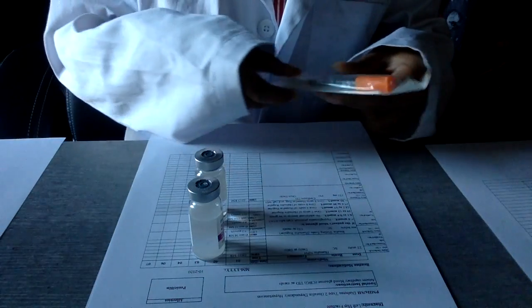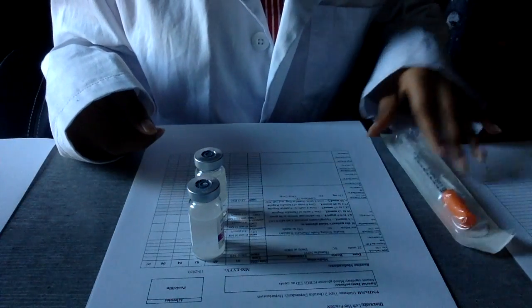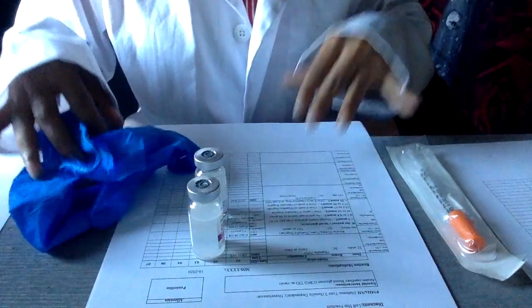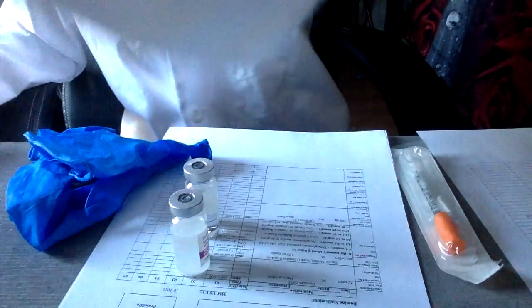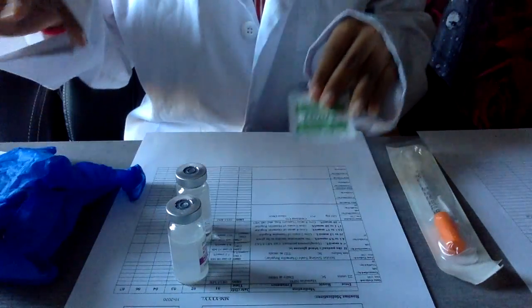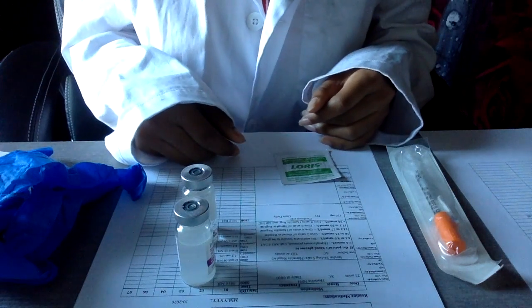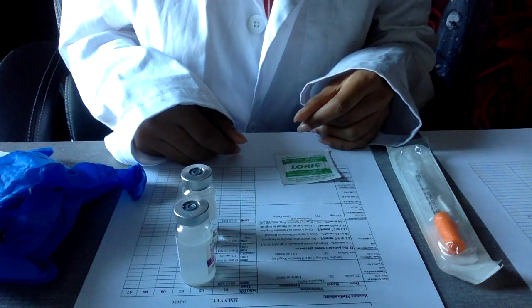And I have a syringe, an alcohol wipe. Alright, so the next step would be to prepare the medication.